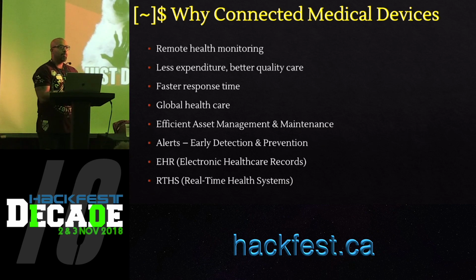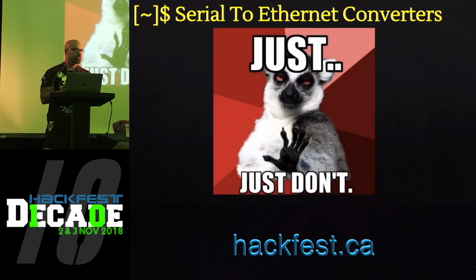So just a while back, I mentioned that some of the devices are considered legacy devices in the sense that they were never meant to be connected to the network, right? And so the way these devices are connected to a network is using serial to Ethernet converters. And using serial to Ethernet converters with those devices is just generally a bad idea because there are tons of vulnerabilities in them. They talk over the serial communication port, which never had any security built into it.